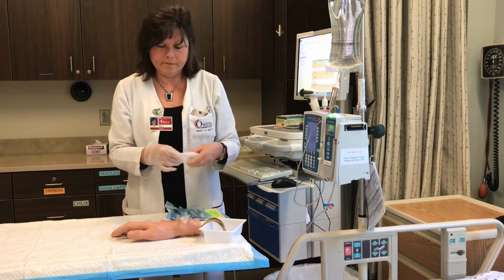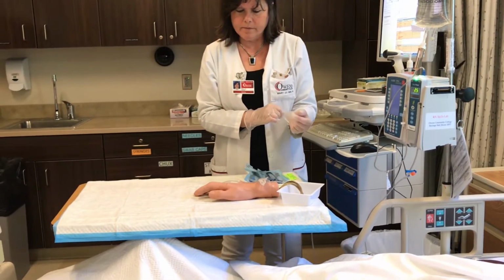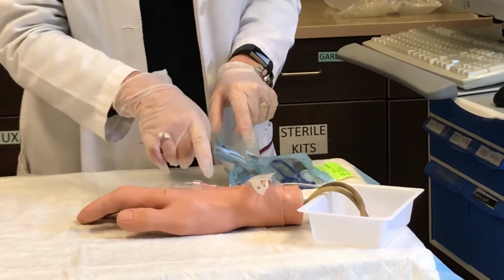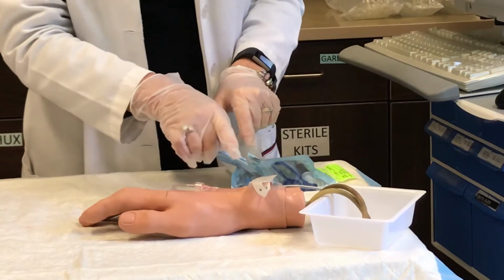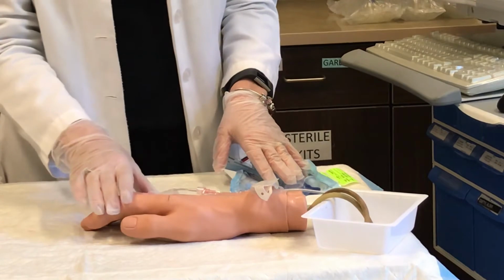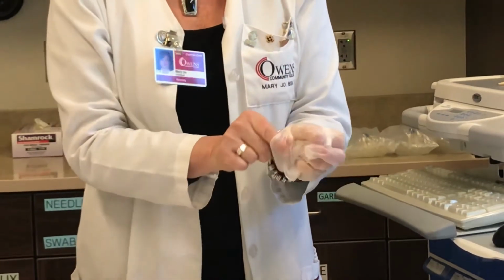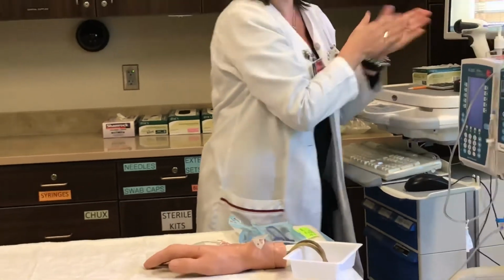Assess IV site for any signs of phlebitis or infiltration. Remove gloves, perform hand hygiene. I'm noting at the insertion site that there's no infiltration, which would be swelling and coolness to the touch. There's no phlebitis, which would be warmth, tenderness, and redness at the site. I'm asking the patient if there's any discomfort. And I'll remove my gloves correctly, glove to glove, skin to skin, and wash my hands.